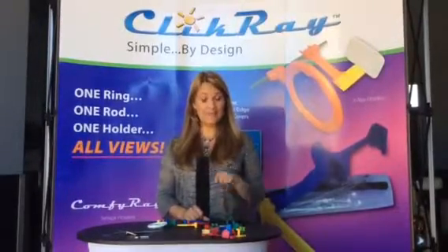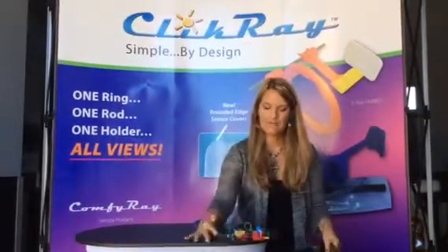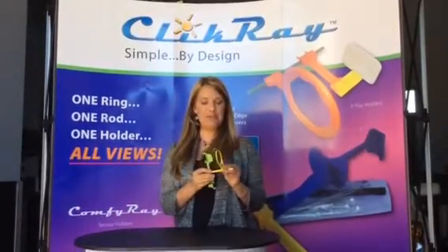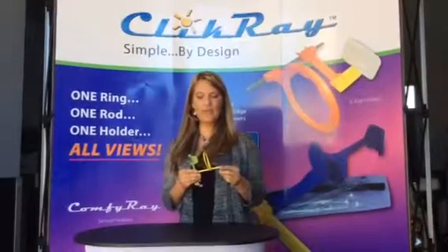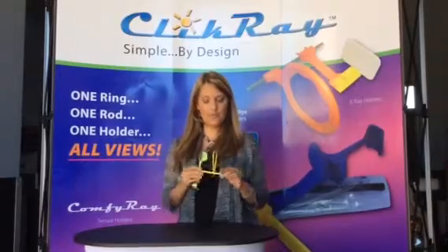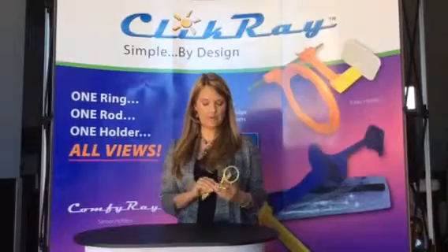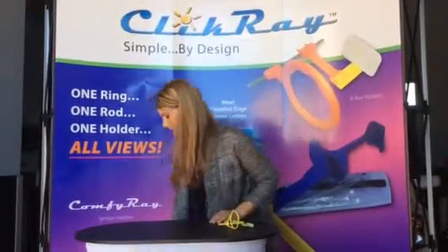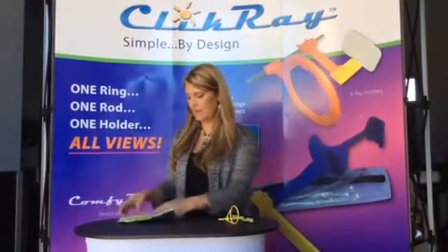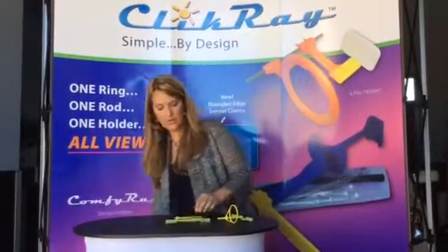The first thing we're going to do today is get rid of all of this. This is what your new system is going to look like. With the ClickRay system we have one ring, one rod, and one holder for all views. With this little system you can take an entire full mouth x-ray without having to have all those different parts and pieces. When you get your DEXUS system it's going to come in a bag that looks just like this. There are two systems that typically come in a pouch and you're going to take out one ring, one rod, and one holder.